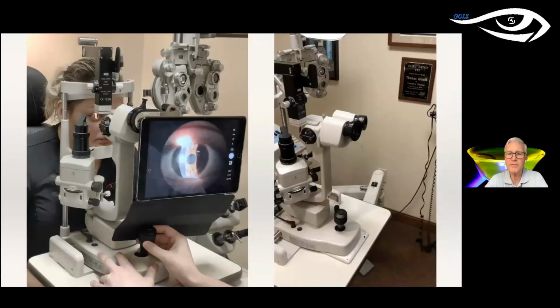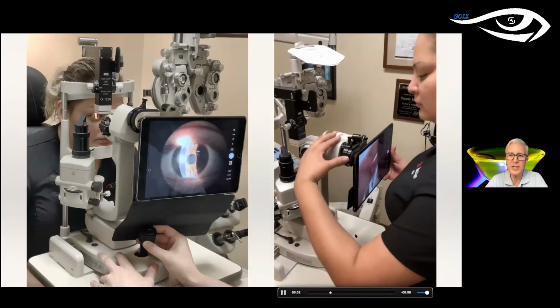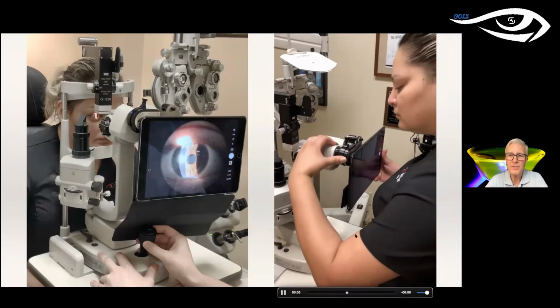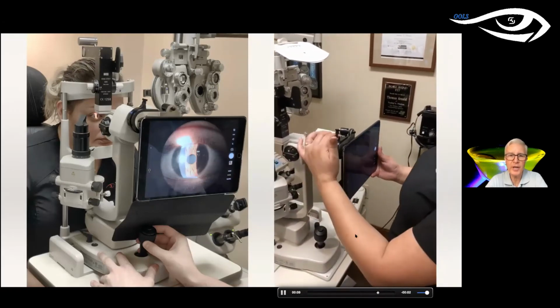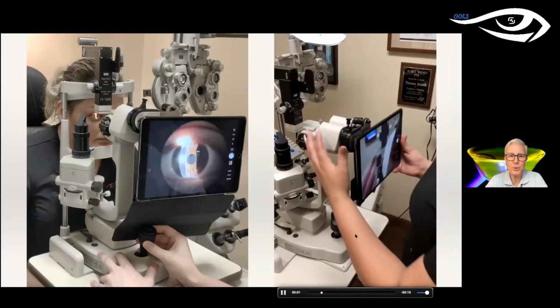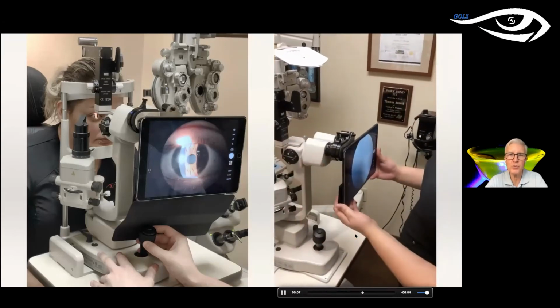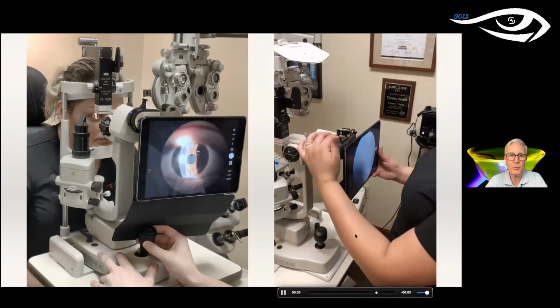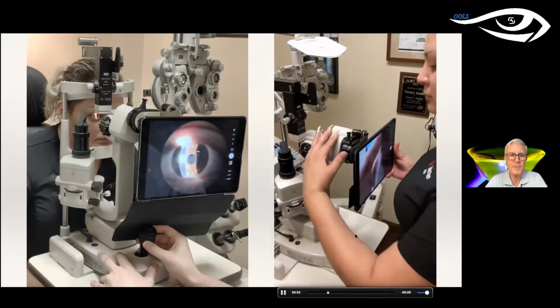A variation of that is a ring attachment, and I'll show you this little video here. One of my assistants is just attaching it. So that way it's not a portable slit lamp. You're using the slit lamps you have, and all you have to do is buy this little adapter ring and put that on the ocular, and then that whole unit slips on there. So that works really well. And you have all the resources and all the bells and whistles that an iPad gives you.